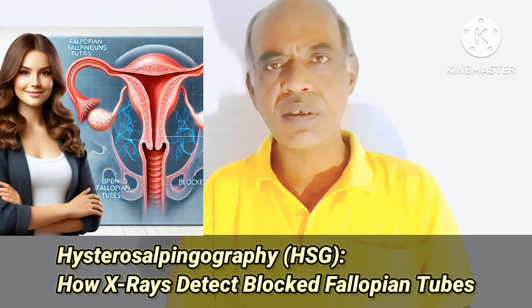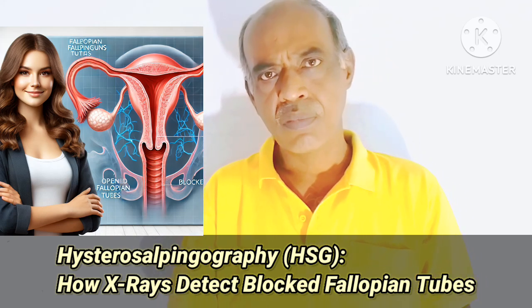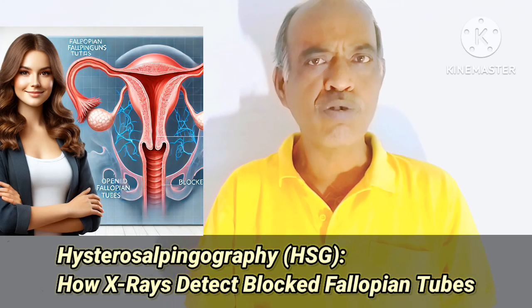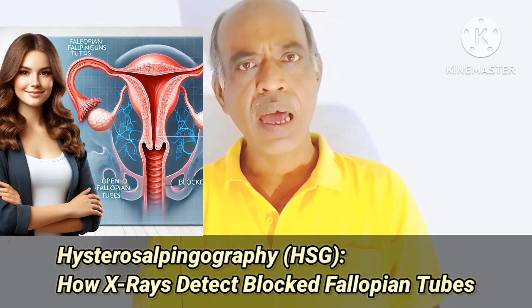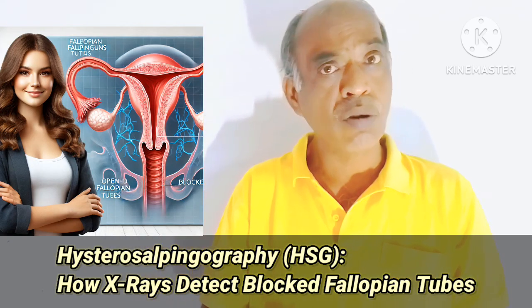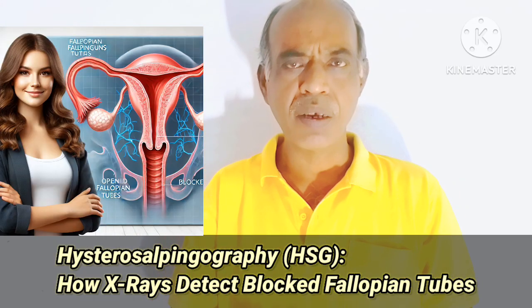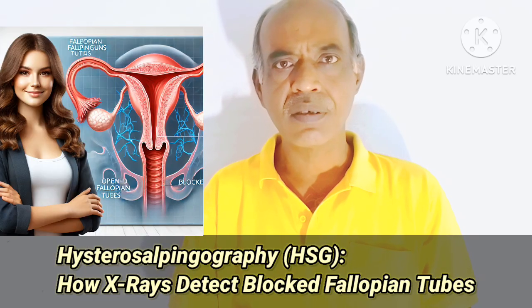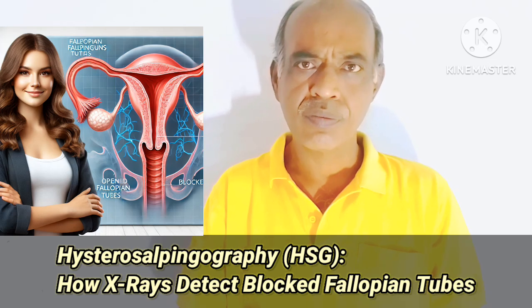Here, let's focus only on the X-ray imaging technique. How is this done? What is the procedure actually? You know, in our body, bones are there, and tissues are there. X-rays can easily pass through the tissues, but cannot easily pass through the bones, because bones absorb X-rays very well, but tissues allow them to pass through.